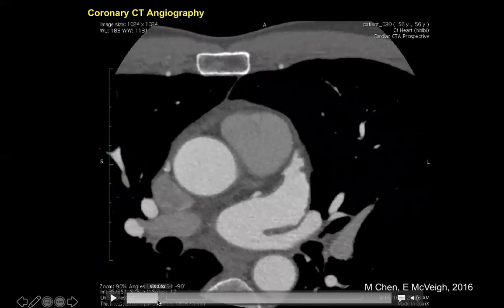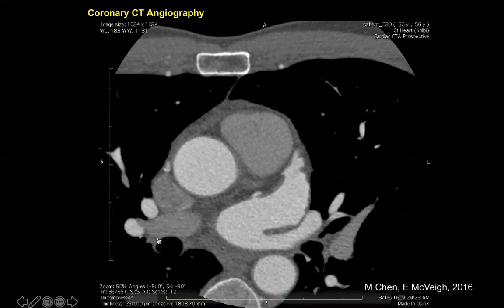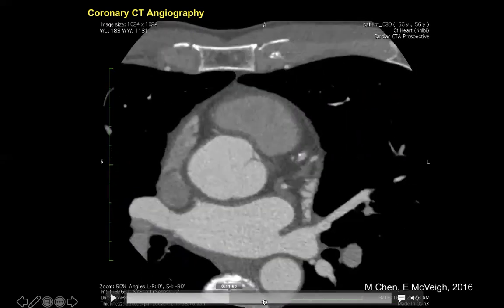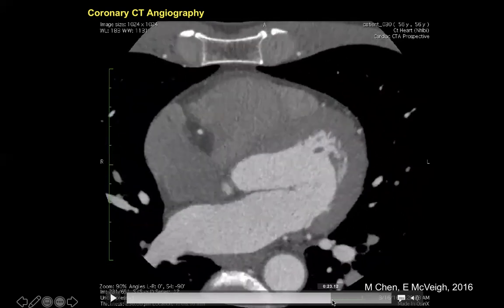This is now in the field as a product, and people are not just using it for cardiac. In fact, it's difficult to use it for cardiac for a number of reasons, but they're using it for lung scanning and temporal bone scanning, things like that, for really high resolution applications. And it's just being determined what are going to be the killer applications for this super high resolution device.